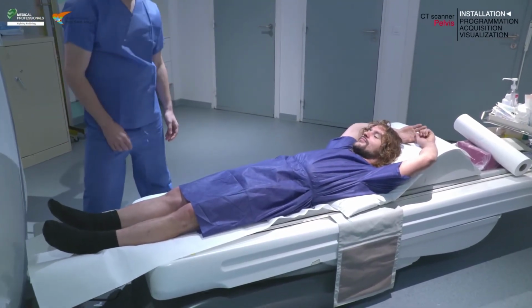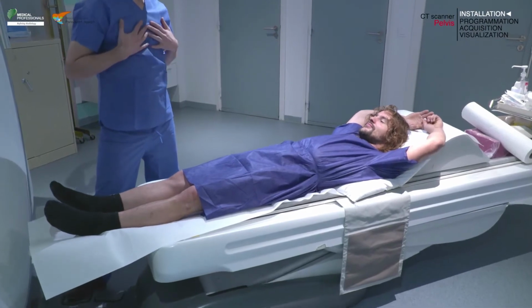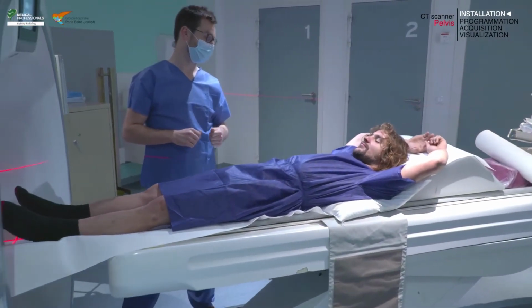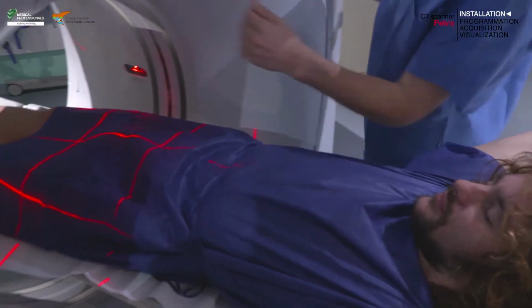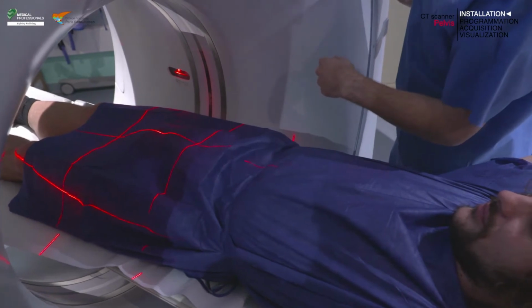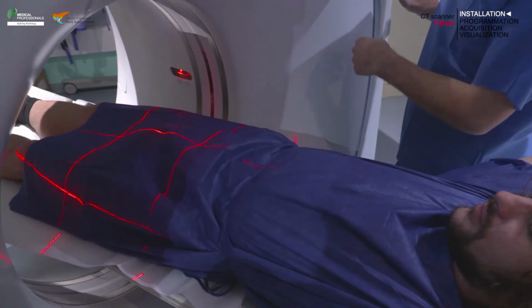The possible anatomical landmarks for the centering of the axial laser light are the iliac crests or the upper edges of the pubic symphysis. For example, in this video, we had chosen to place the centering point on the iliac crests with the external axial laser light. Make sure that the lateral laser light is at the mid-thickness of the pelvis and that the longitudinal laser light is placed in the median sagittal plane.